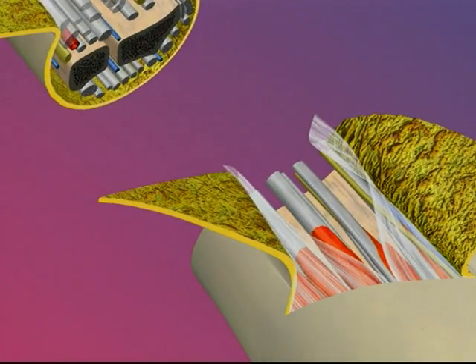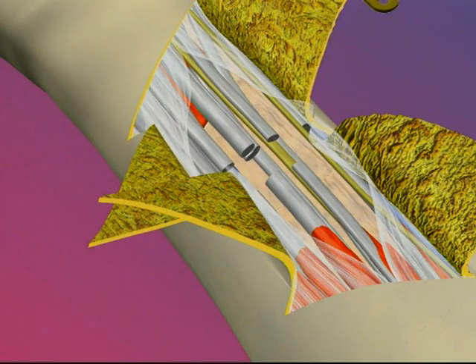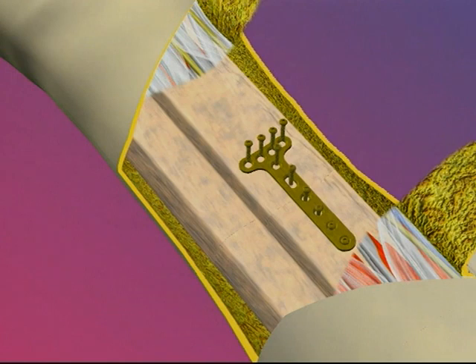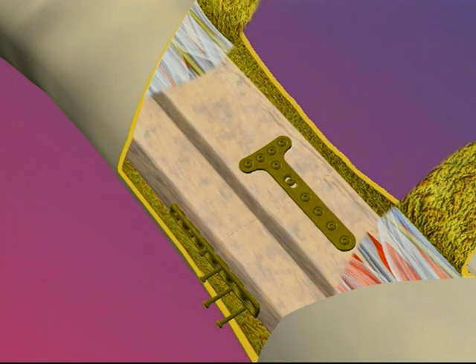Dissection is made through the soft tissue to locate the radius and ulna bones. The surgeons first connect the radius bone together using a metal T-plate. A second plate unites the ulna bone on the lateral side.